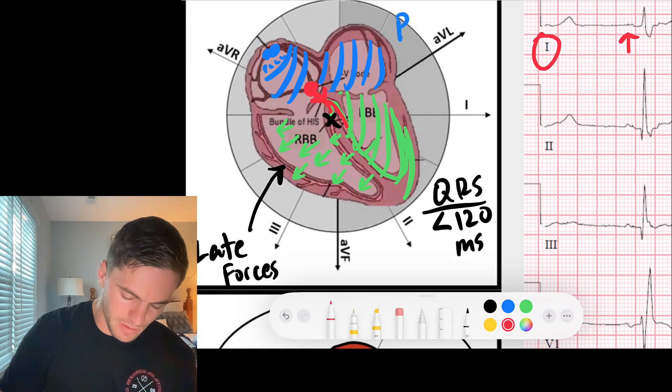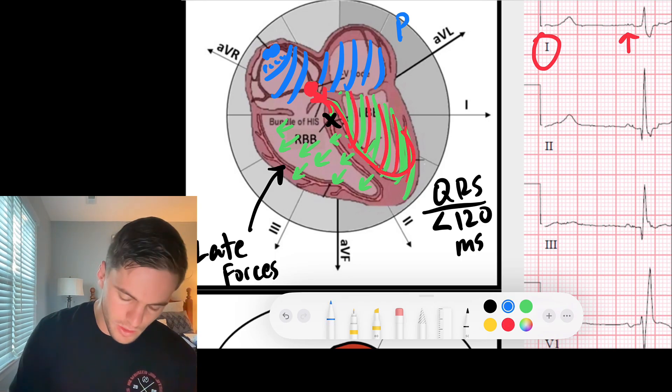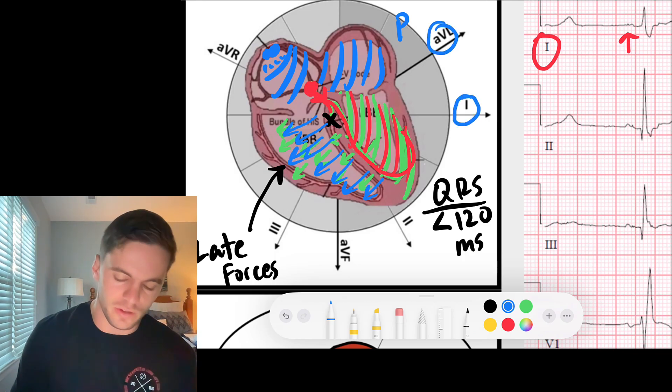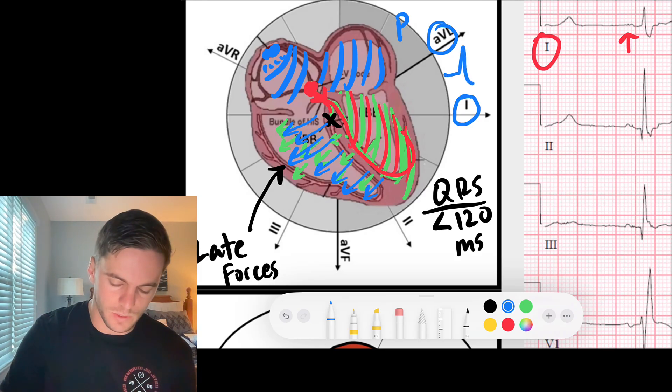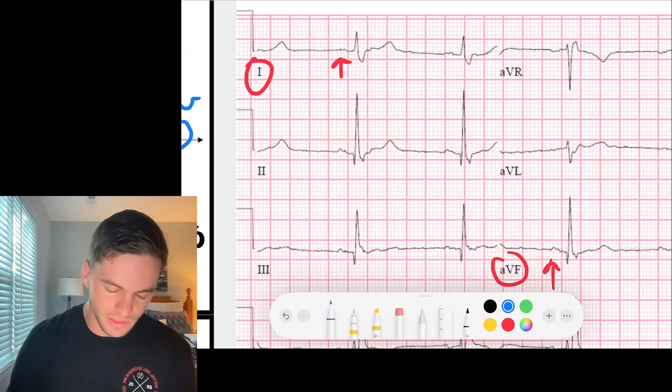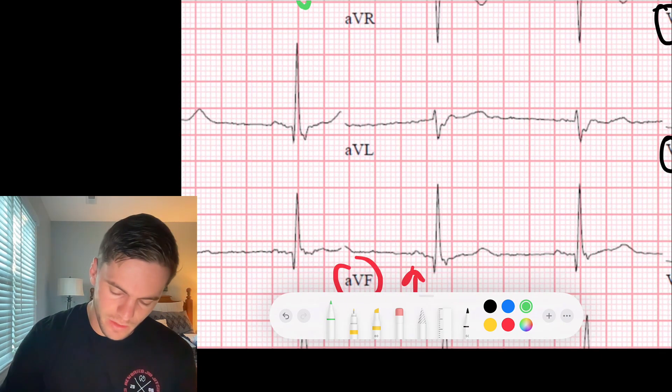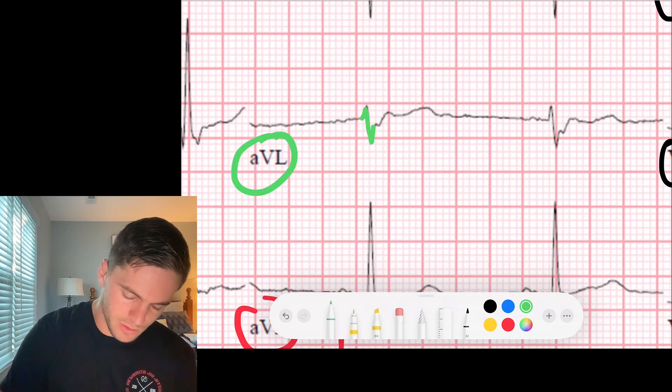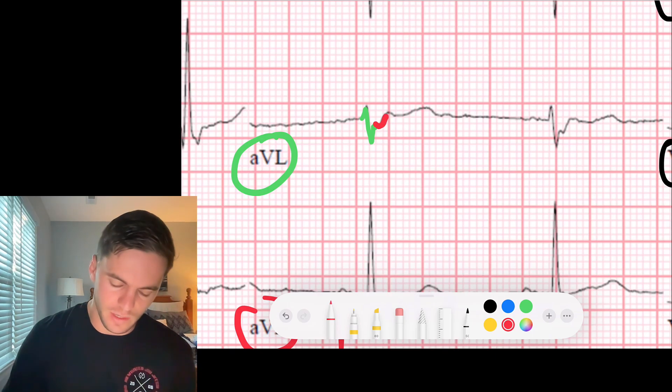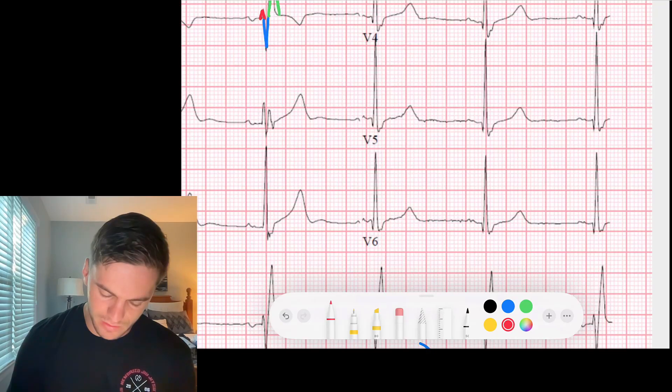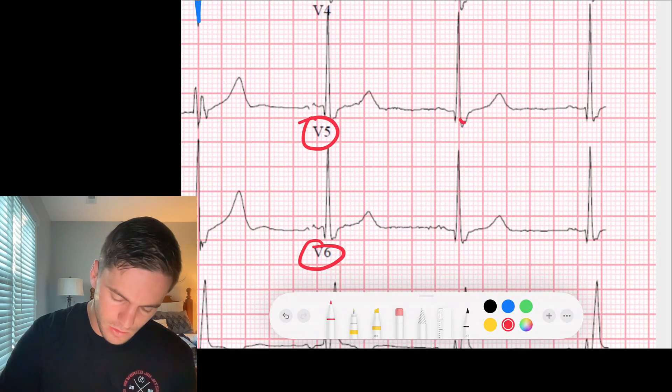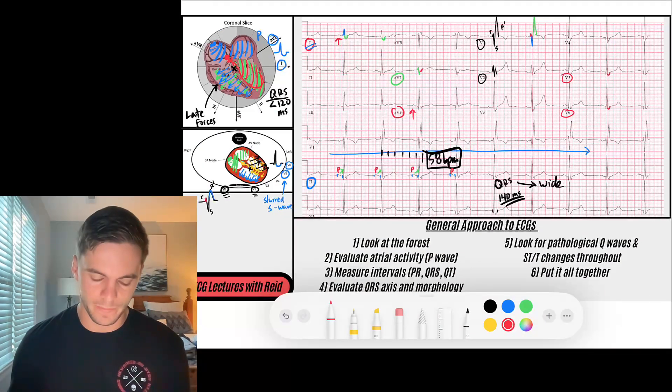What you're also going to see slurred S waves is if I go to my limb leads. We've got rapid conduction down the left bundle, fast conduction down the left bundle, and then we get slow gap junction to gap junction towards the right ventricle. So where else should I see slurred S waves? Well, these forces are going away from lead 1 and lead AVL. So we're also going to see those same types of slurred S waves in lead 1 and AVL. And that's the right bundle branch block.